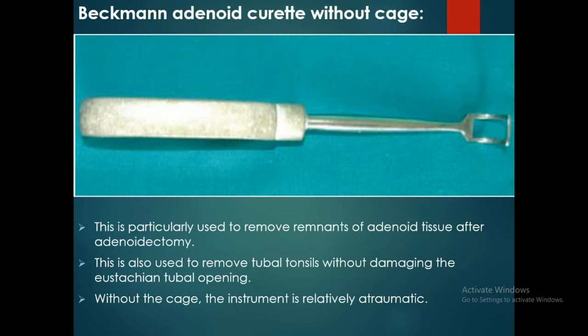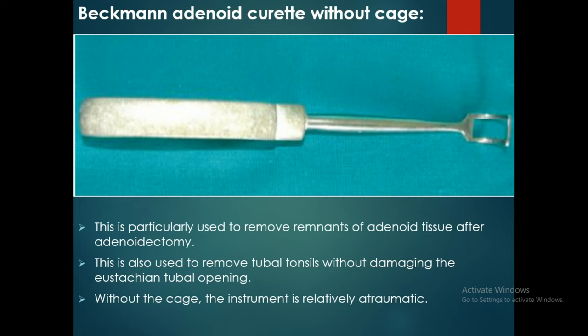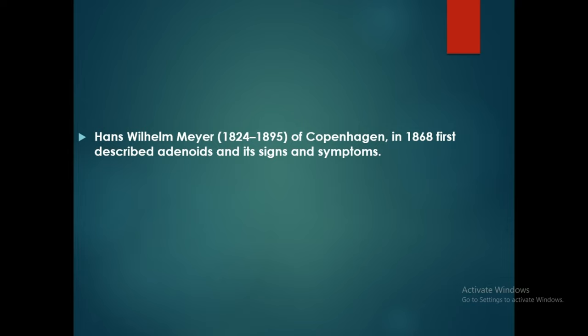This is the Beckmann adenoid curette without cage. It is particularly used to remove remnant adenoid tissue after adenoidectomy, and also to remove the tubal tonsil without damaging the Eustachian tube opening. Without the cage, the instrument is relatively atraumatic.